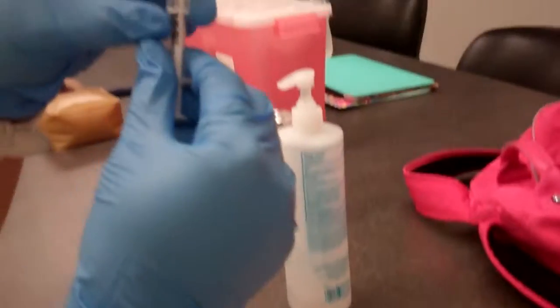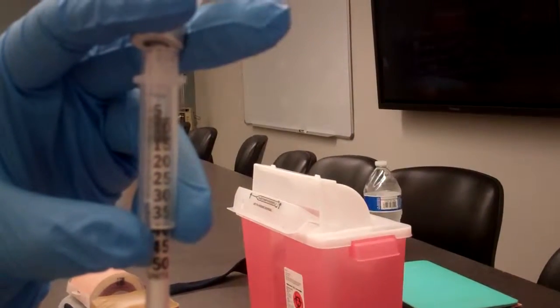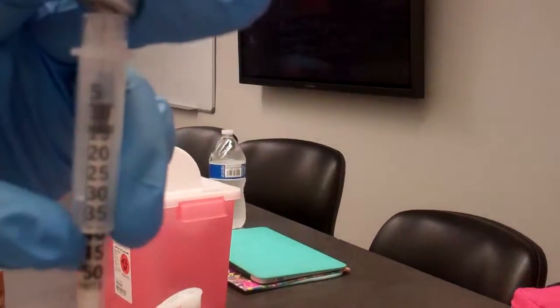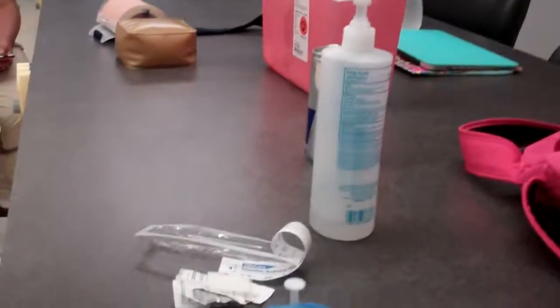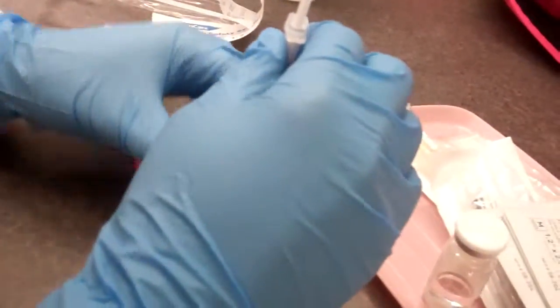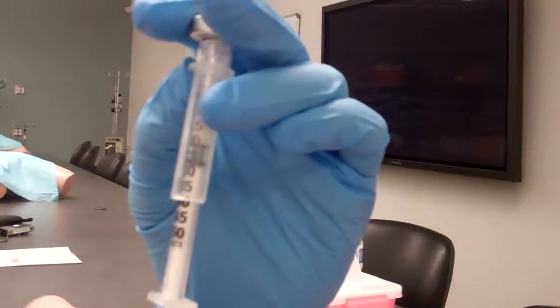So now I'm going to withdraw 8, 5, 6, 7, 8. Okay, I'm going to have another nurse verify what this medication is. 8. Regular. Okay, thank you. And now I'm going to insert into my NPH, and then withdraw up to the 43 mark, making sure I have no air bubbles.